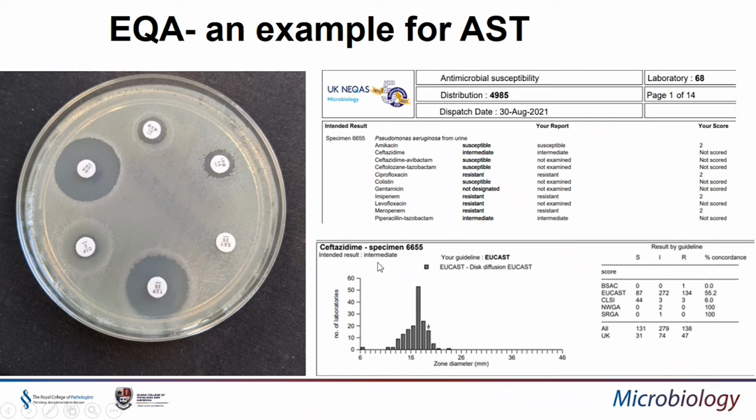But for ceftazidime, in this instance, we've got all UK subscriptions, the different AST guidelines that people are using, and the percentage of concordance.